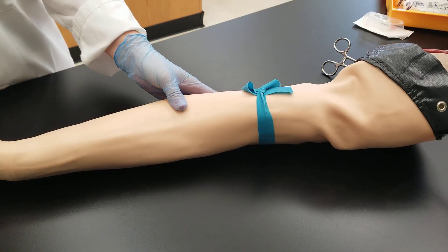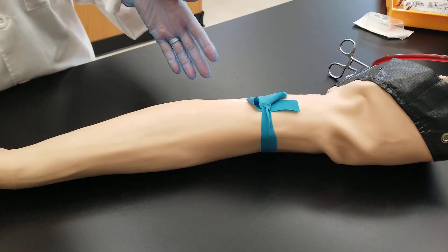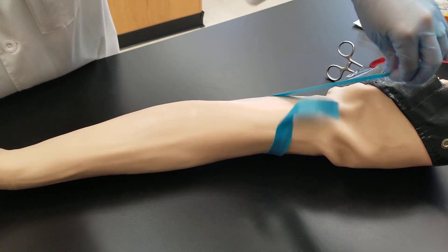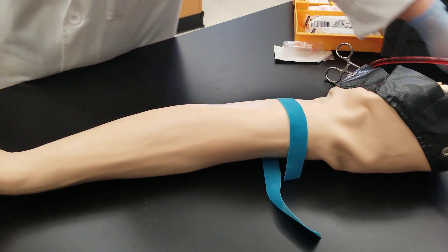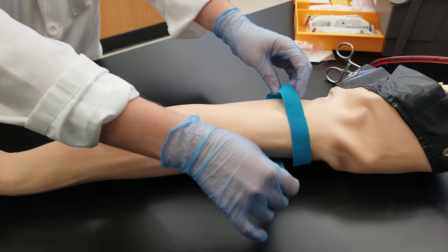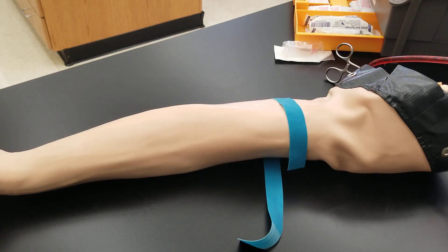Then you can start your venipuncture process afterwards, so you can remove the tourniquet just like we did before. Get your supplies ready from your tray that you brought with you, talk with the patient, cleanse the area, and then start your venipuncture procedure. We will cover that in another video — thank you so much for watching, have a great one, bye.